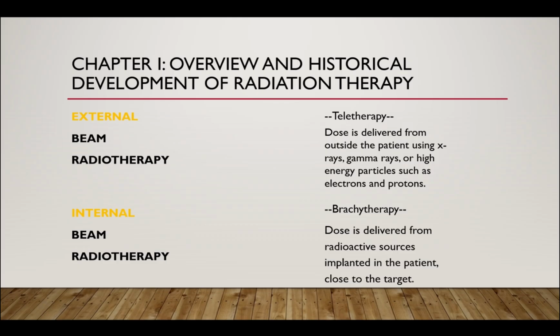Your external beam radiotherapy is also called teletherapy, coming from the word tele, which means from a distance or from outside the patient's body.